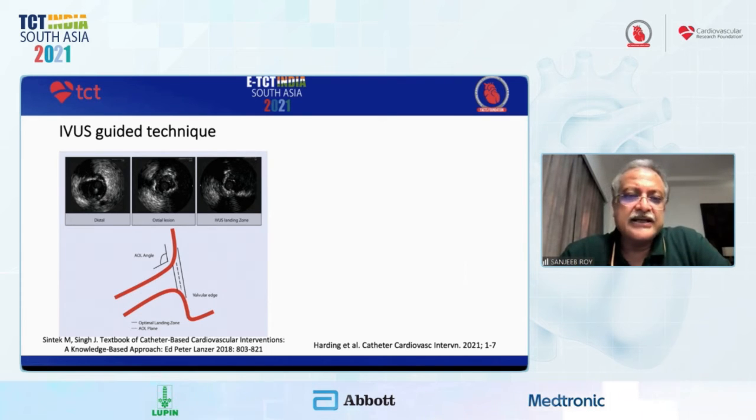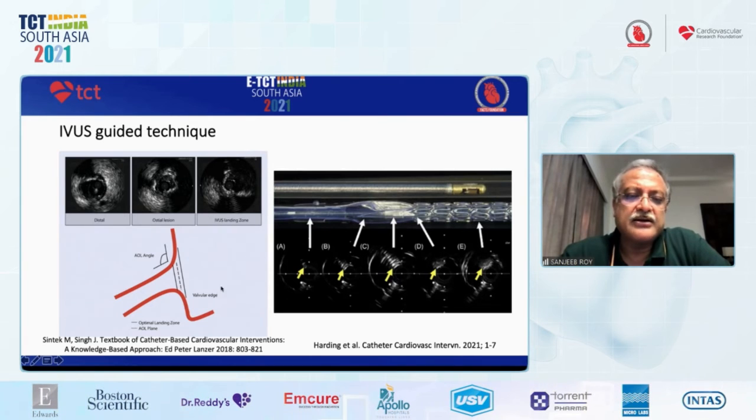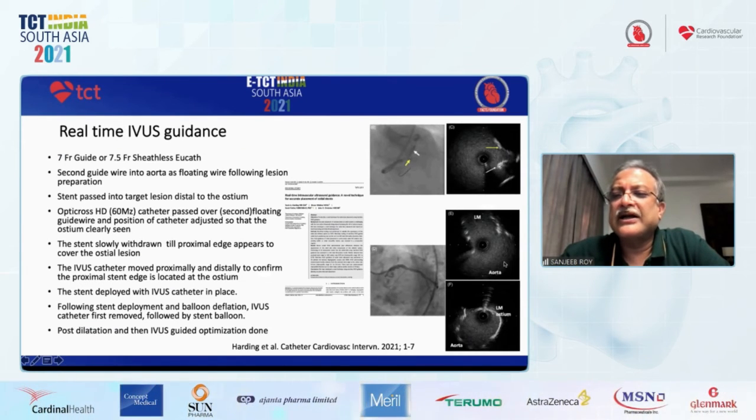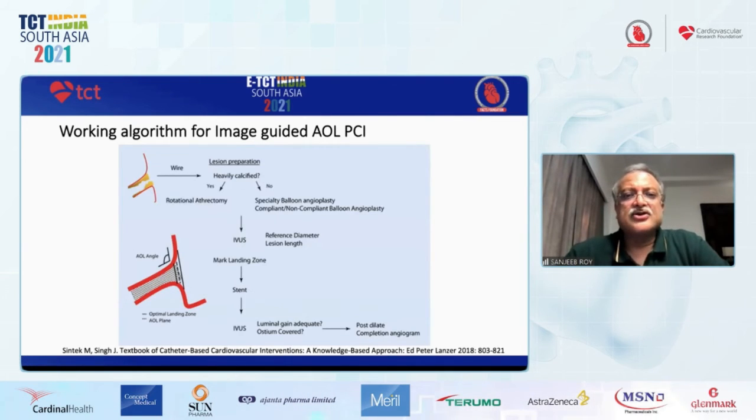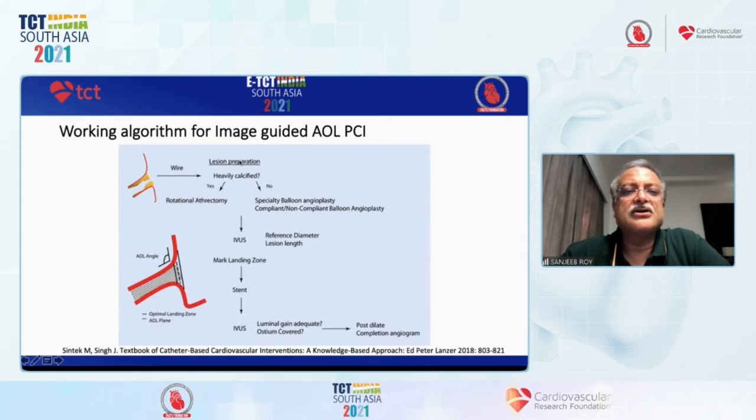IVUS guided, again, here you place the IVUS in your septal wire, floating aortic wire, and you can see here the stent edge when you are deploying, and this is how it is profiled, and you can deploy it on the IVUS guidance.